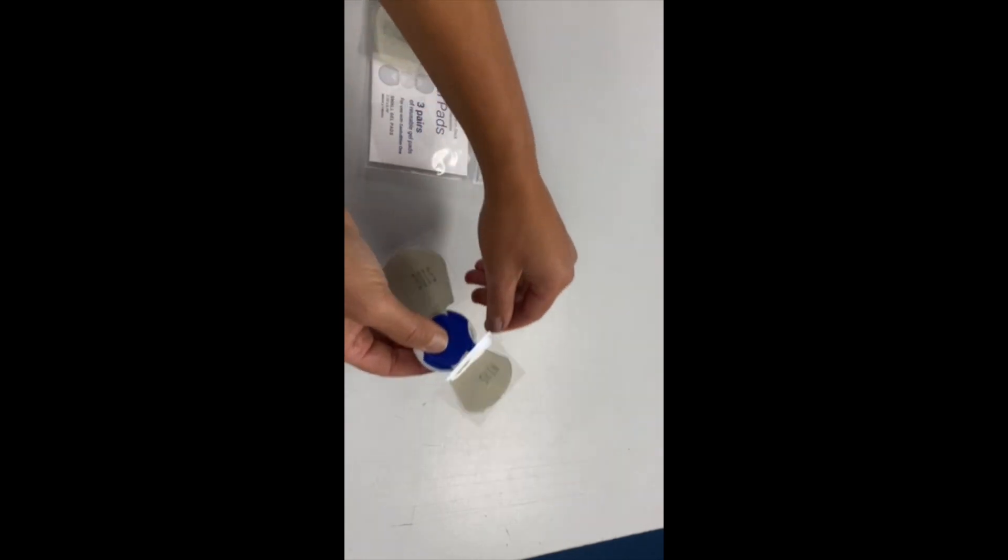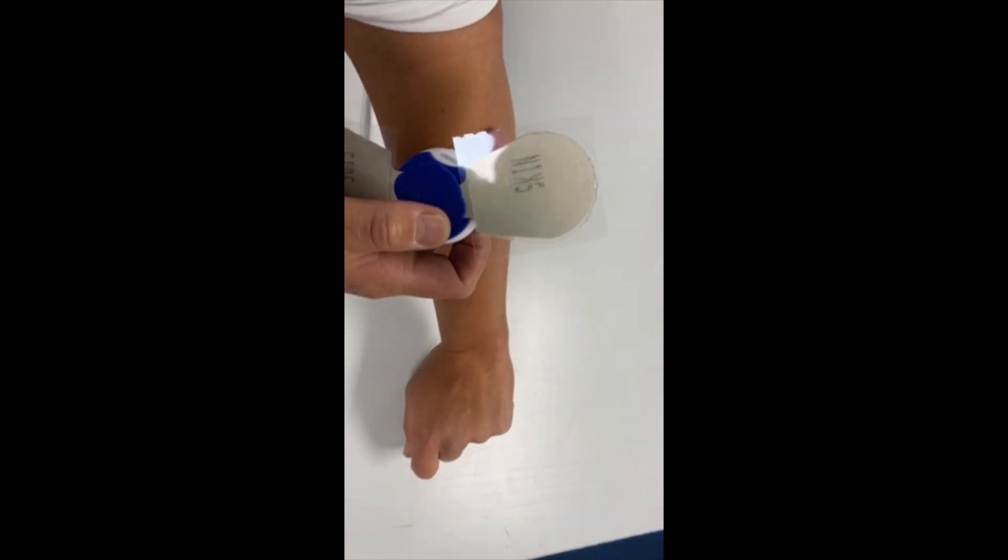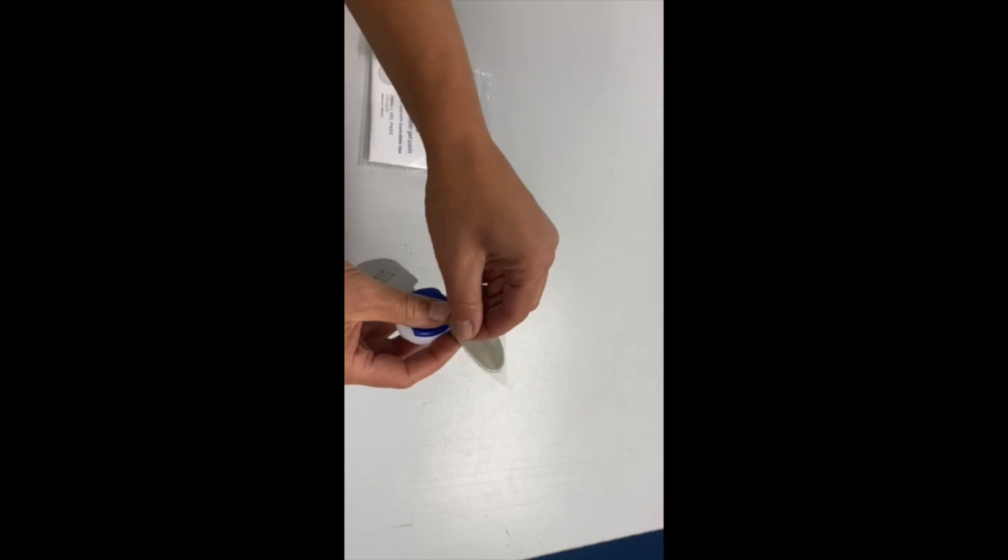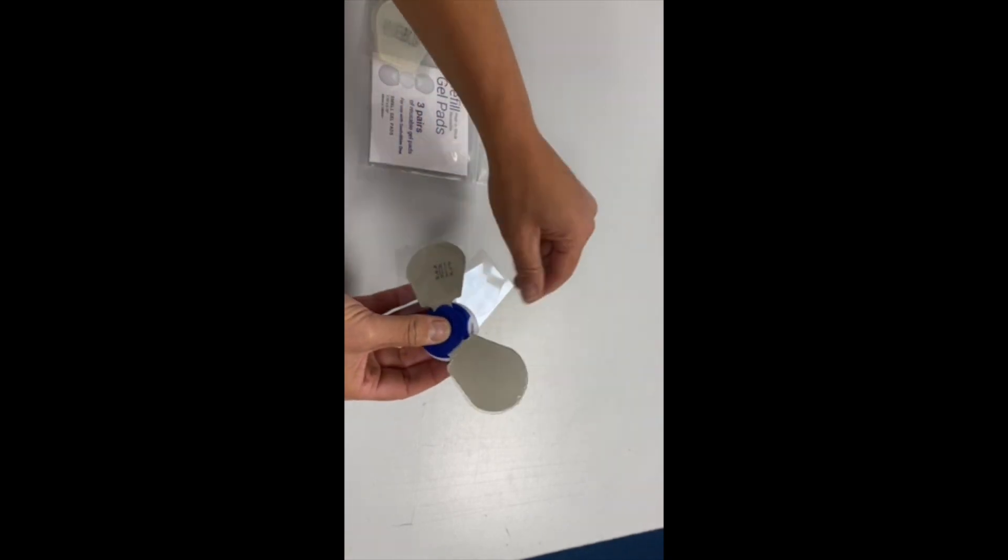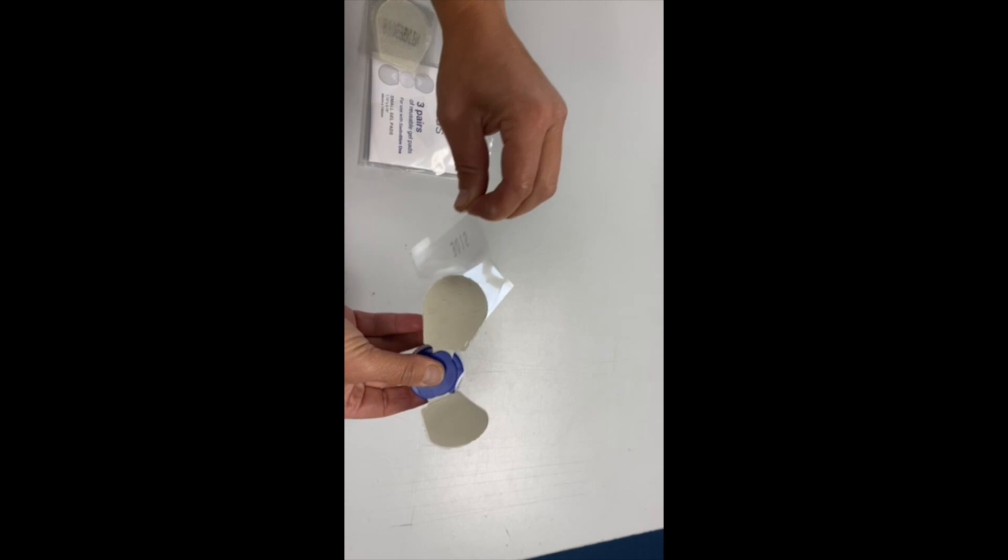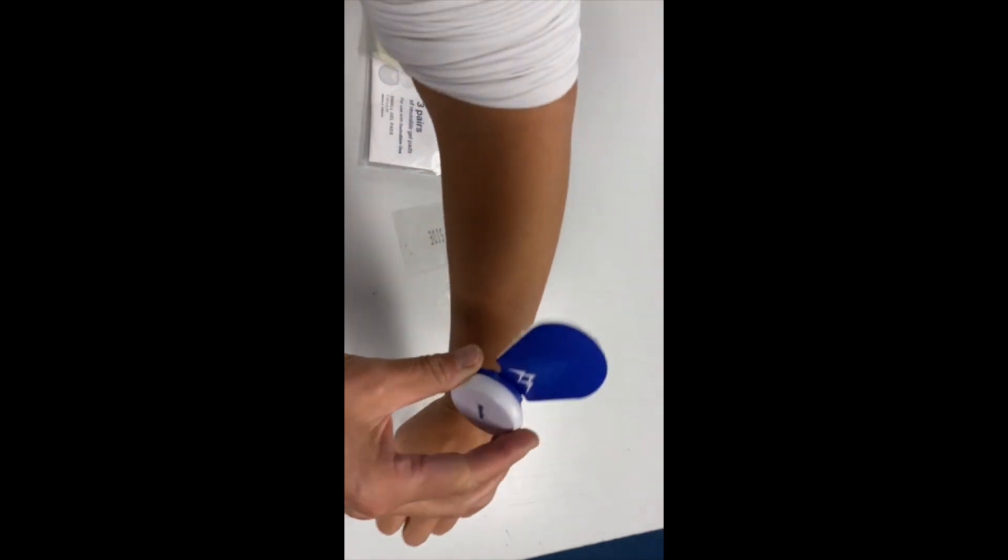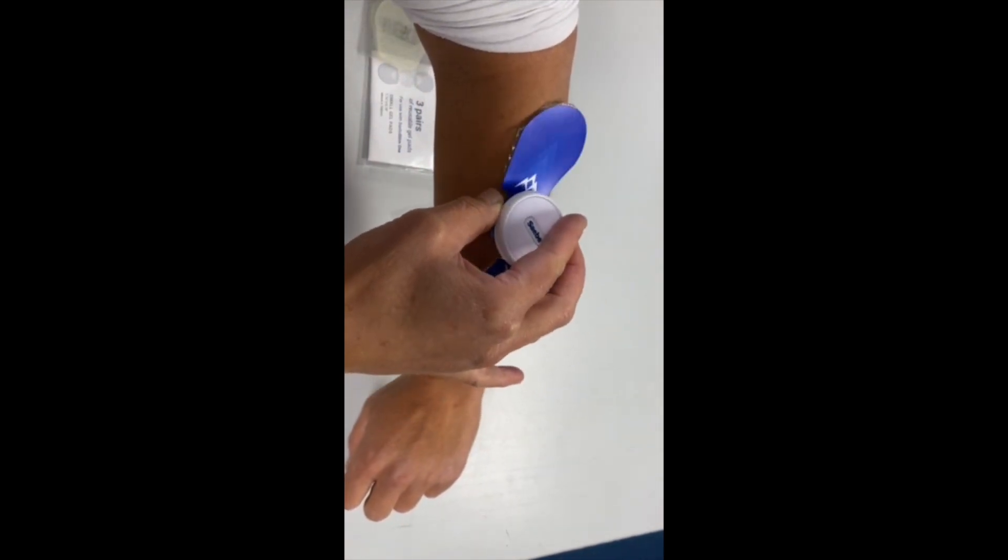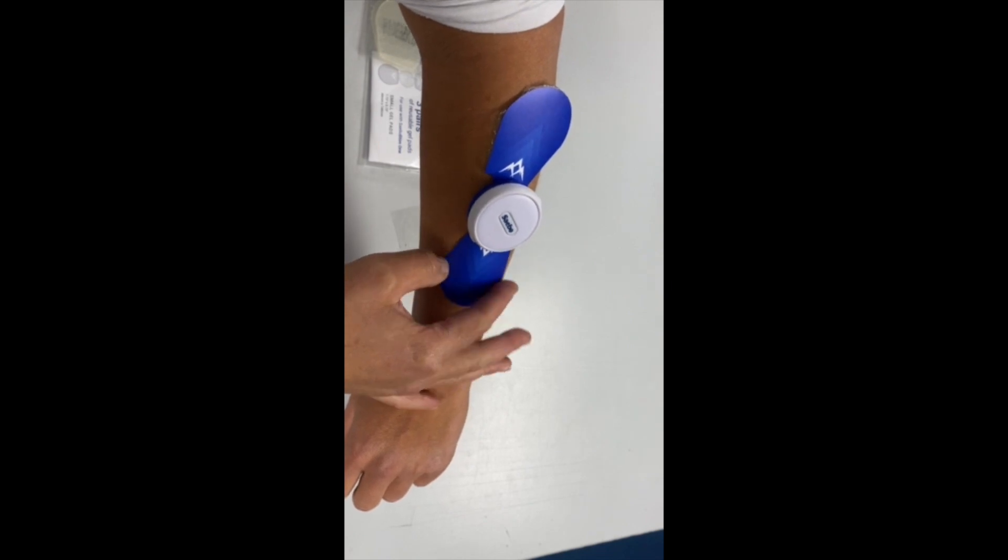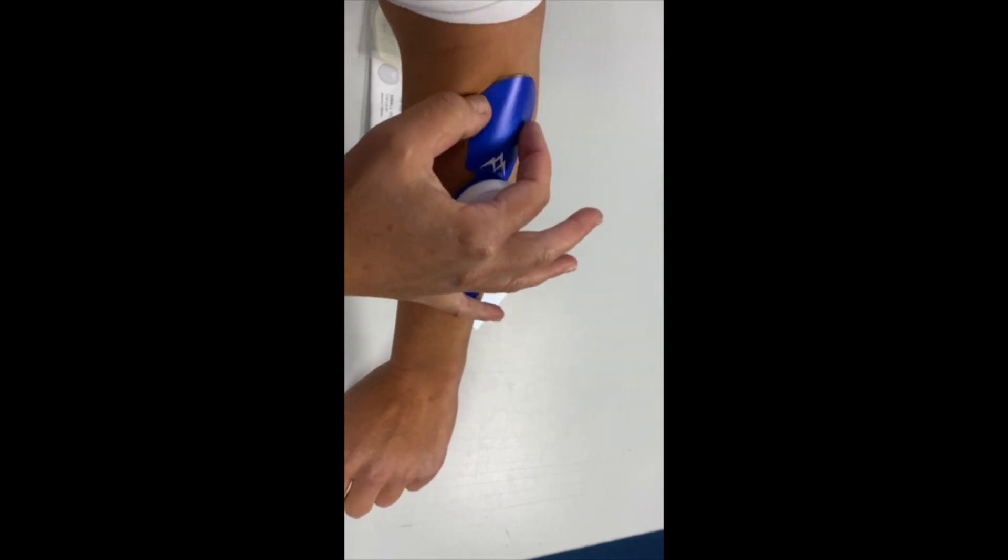You can use this on any muscle. I'm going to use it on my forearm, wrist, and finger extensors. Remove the final piece of clear plastic backing and place it on your arm. You can find examples of where to place it for different movements in the back of the manual.